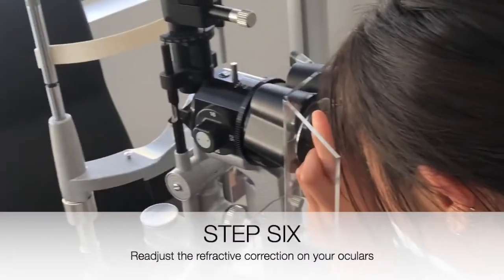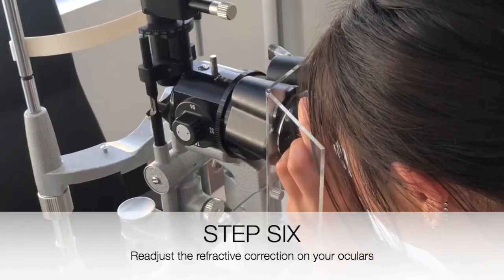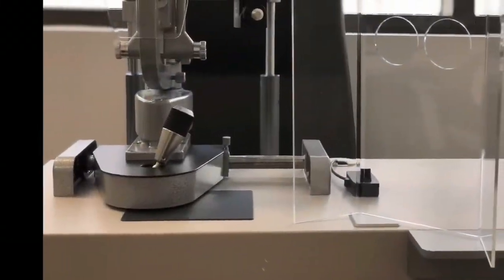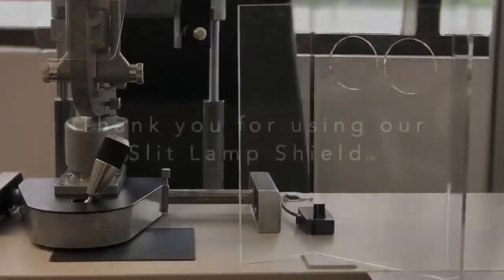Step 6: Readjust the refractive correction on your oculars to zero, or as appropriate for your personal setting. Thank you for using our slit lamp shield.